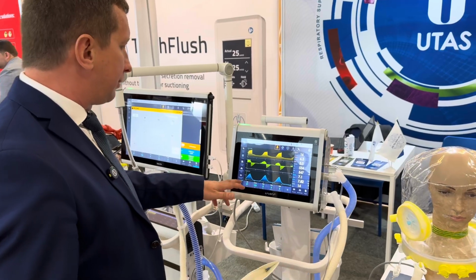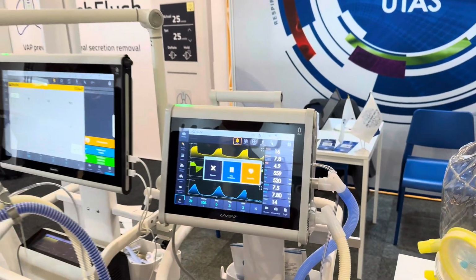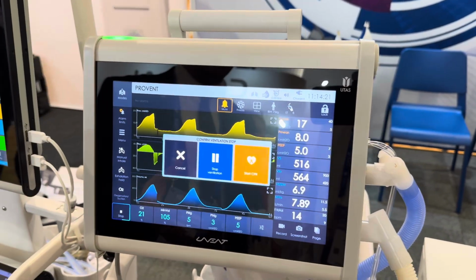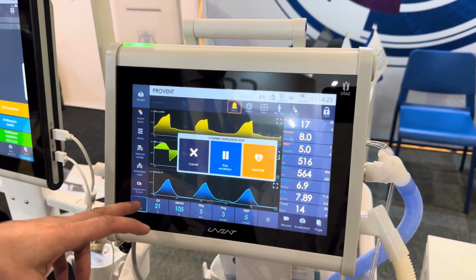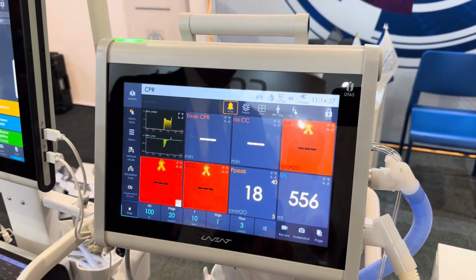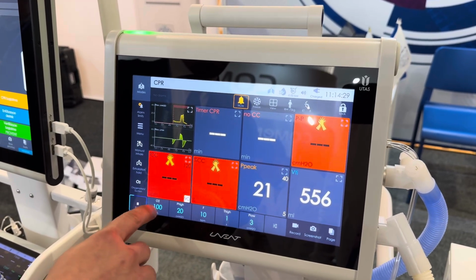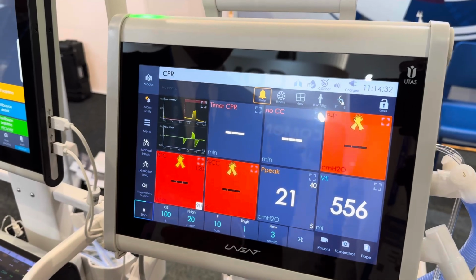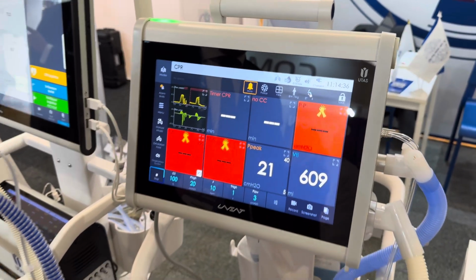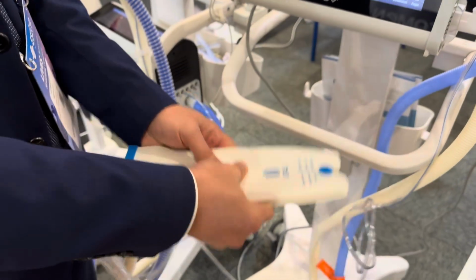And we have one specific ventilation mode, cardiopulmonary resuscitation. In case a heart attack happens, the doctor can simply activate the CPR mode with a two-press, while the ventilator will be switched to 100% oxygen with a BiPAP algorithm, and then the doctor can start with the chest compressions.